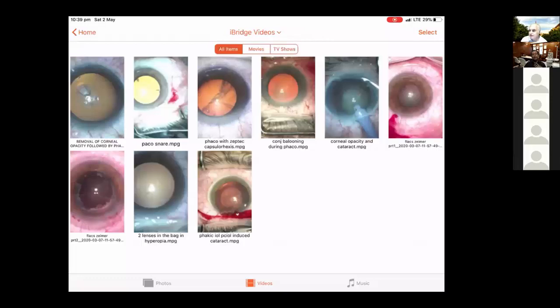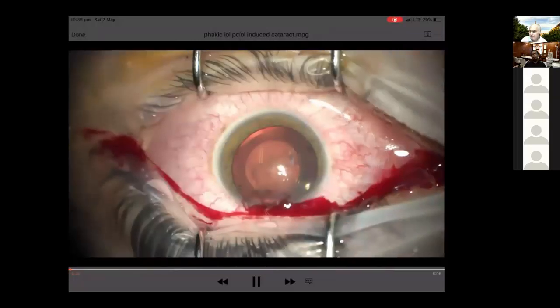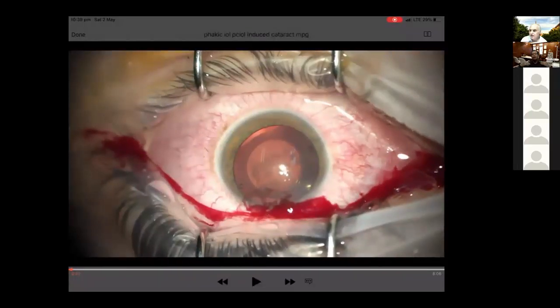But the thing that I assumed is that the vitreous leaked from the trocars when I was introducing them. So the pressure in the vitreous was low. That's why the whole lens was being pushed backwards rather than irrigating the pressure inside the anterior chamber. Okay, it's a good theory.